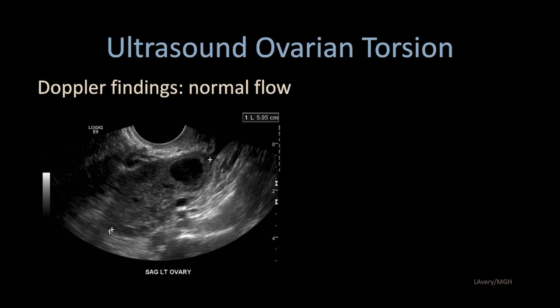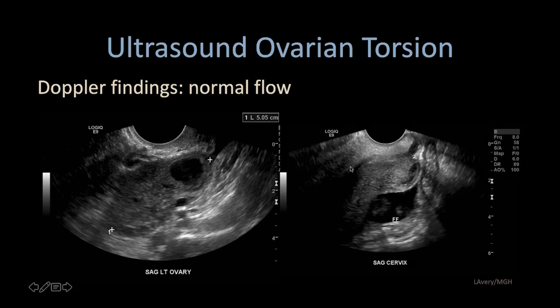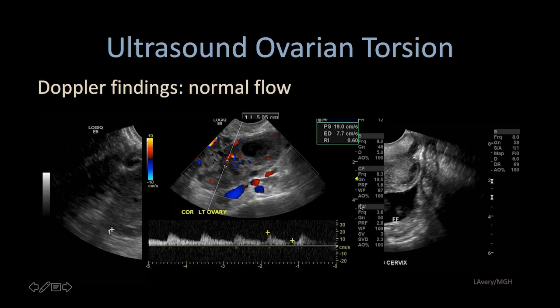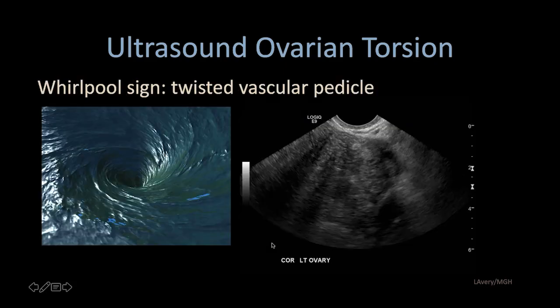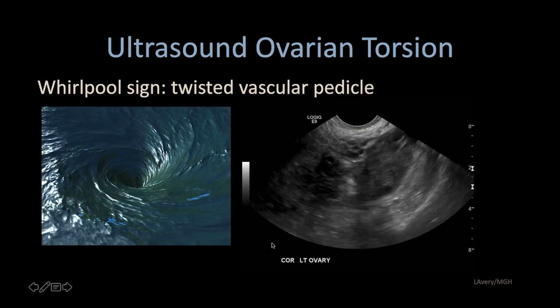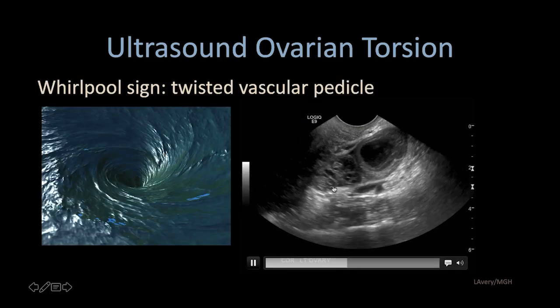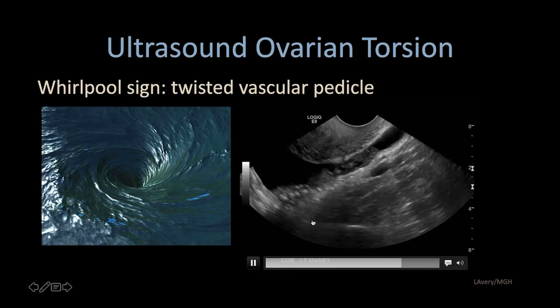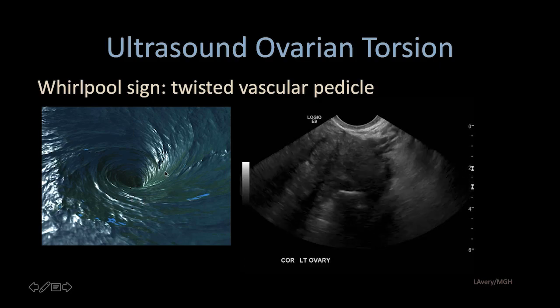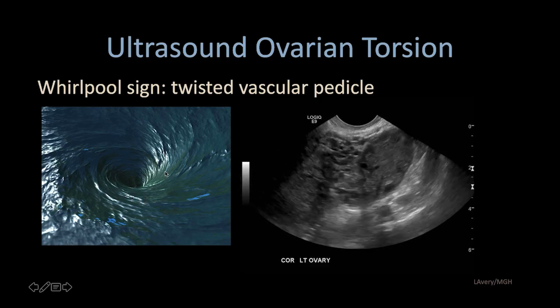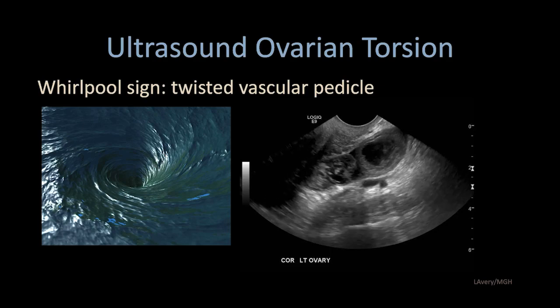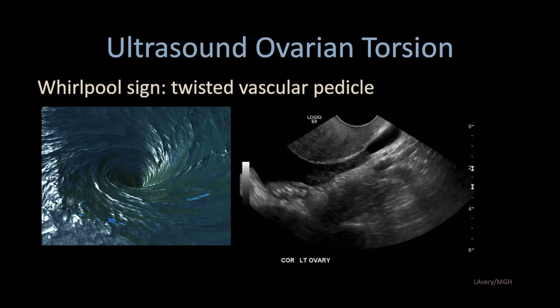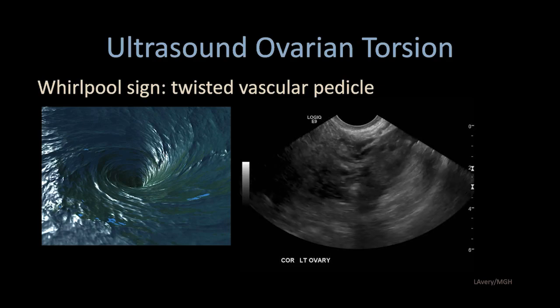Here's an enlarged ovary measuring 5 centimeters with a bit of free fluid in the cul-de-sac. There was normal Doppler flow with a low-resistant waveform. But when we looked at the vascular pedicle, we saw the swirling appearance — the whirlpool sign. This patient went on to laparoscopic evaluation, and indeed a torsion ovary was discovered.